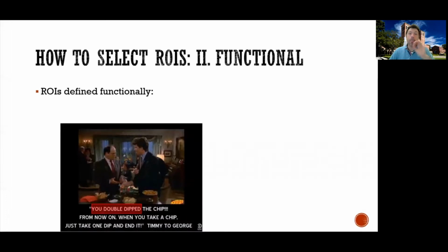And the idea is the possibility that the way in which you selected this ROI, the contrast that you used to select this ROI, might not be independent of the ROI analysis you're planning to do later. And if they are dependent, you actually risk that your result is fully circular, meaning you select an ROI because it responds to a certain task, it responds to task A versus task B, and then inside that ROI, you say, oh, look, inside this ROI, I get a crazy result when I compare task A to task B. Of course, that's how you picked it.